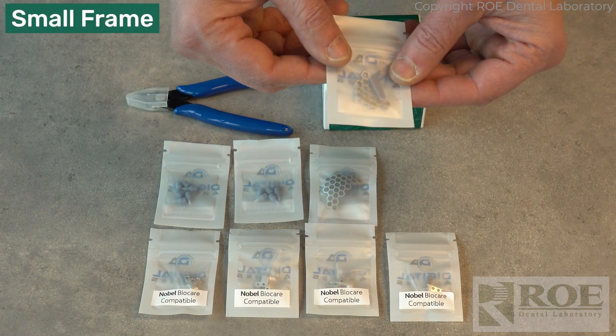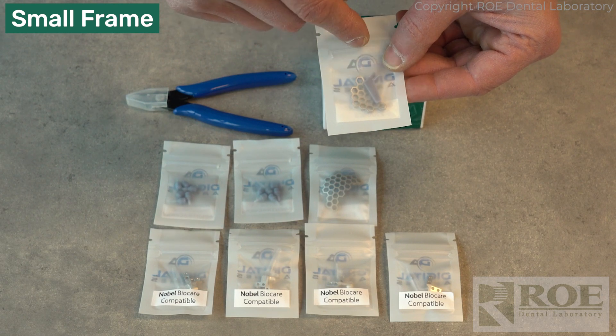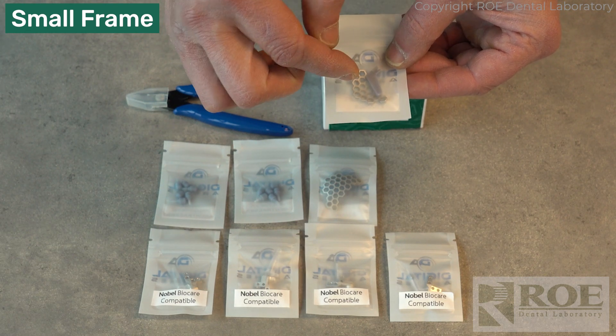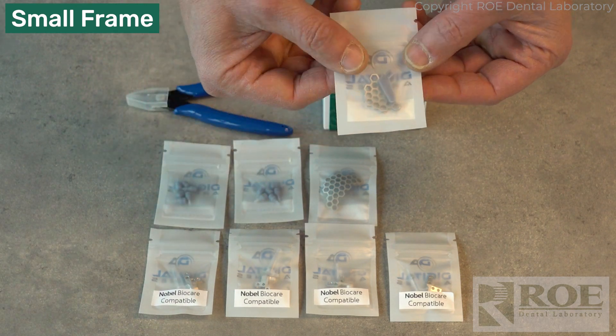The small frame is the one that's used most often. Every package comes with a little handle, and the handle clicks into the middle of a honeycomb, and you can use it to deliver to the mouth. That's what's in that package.